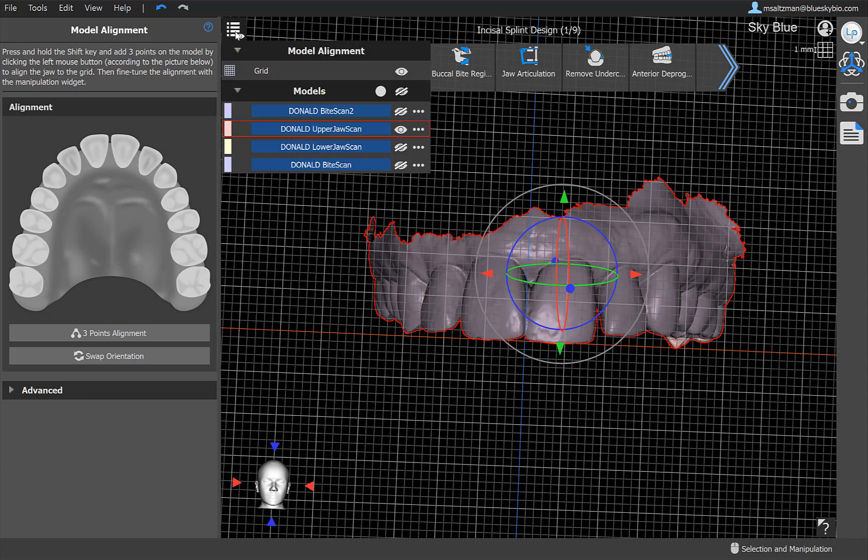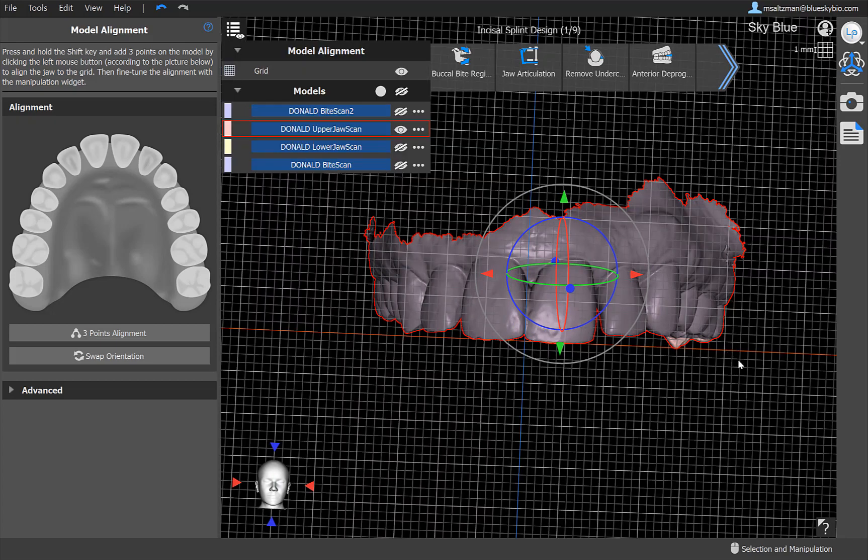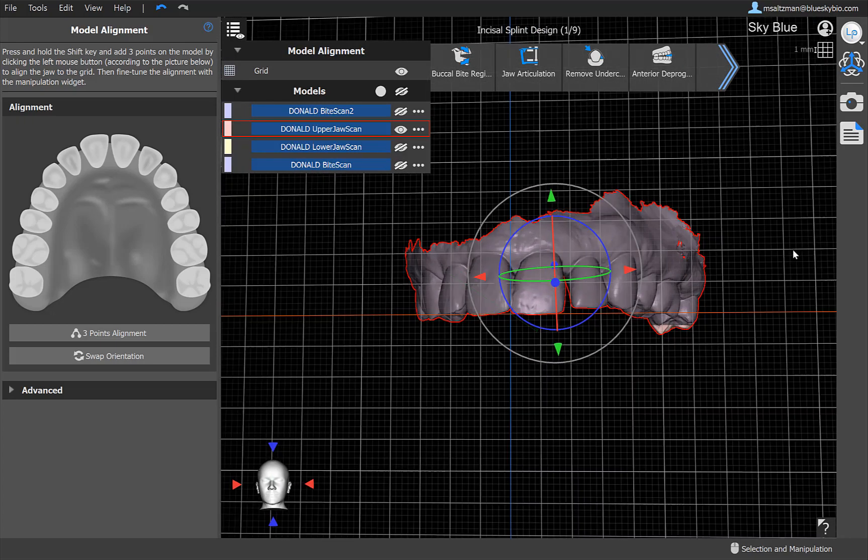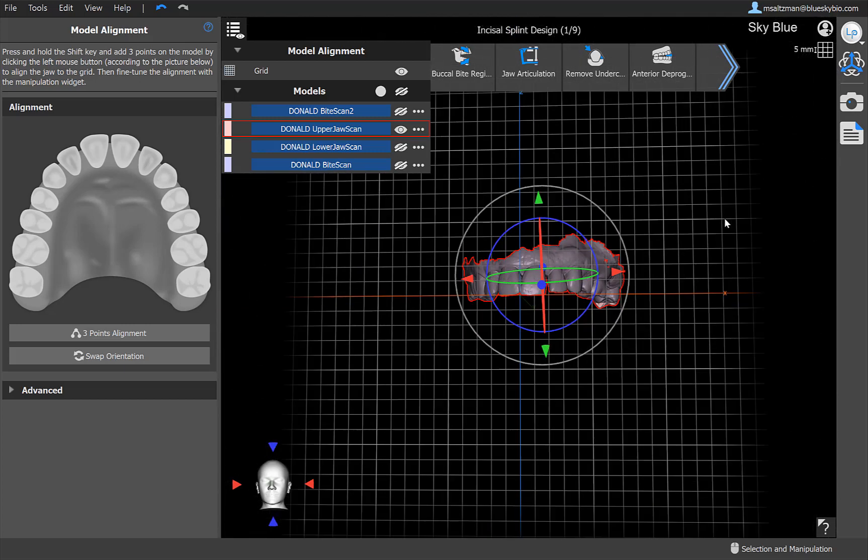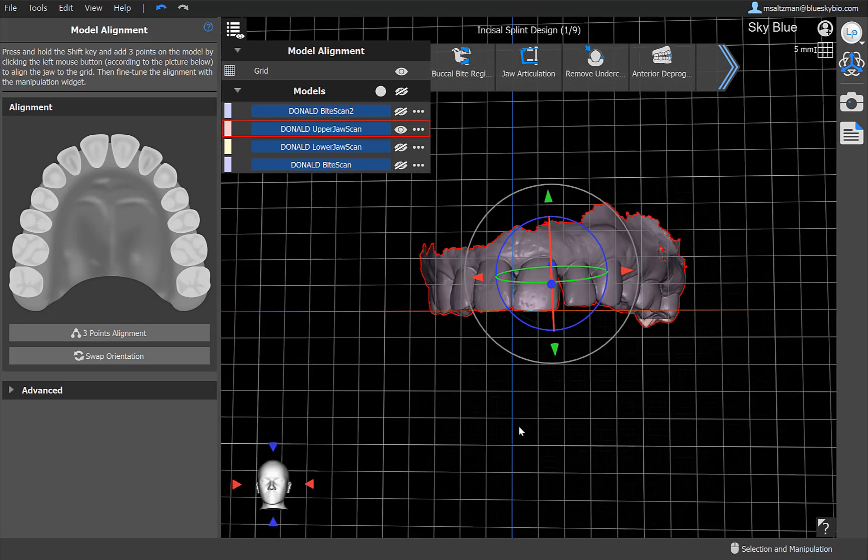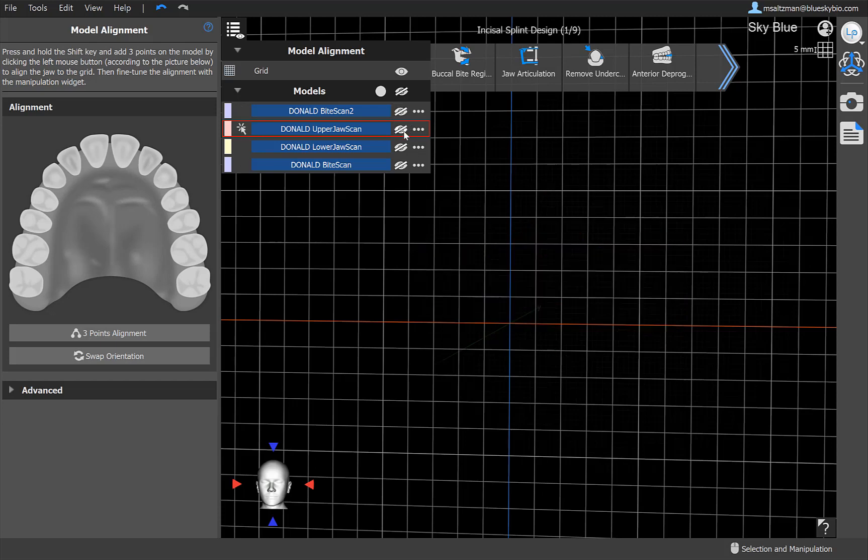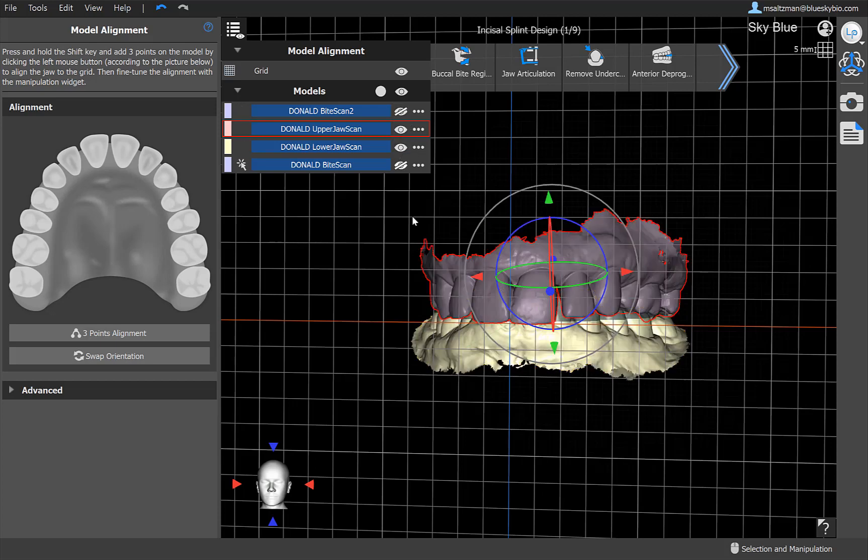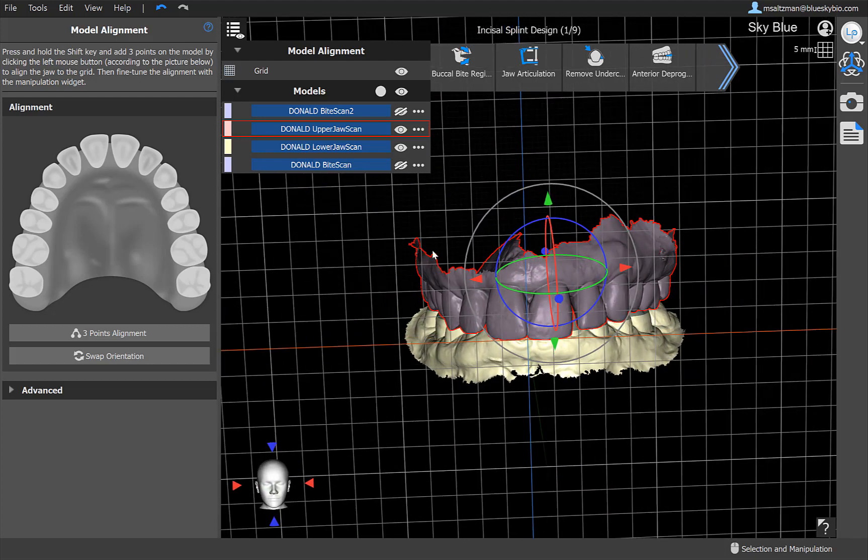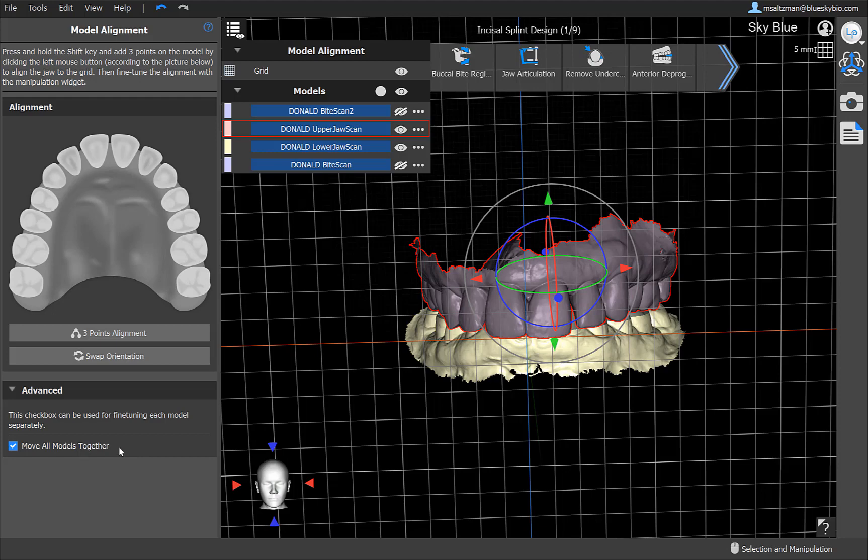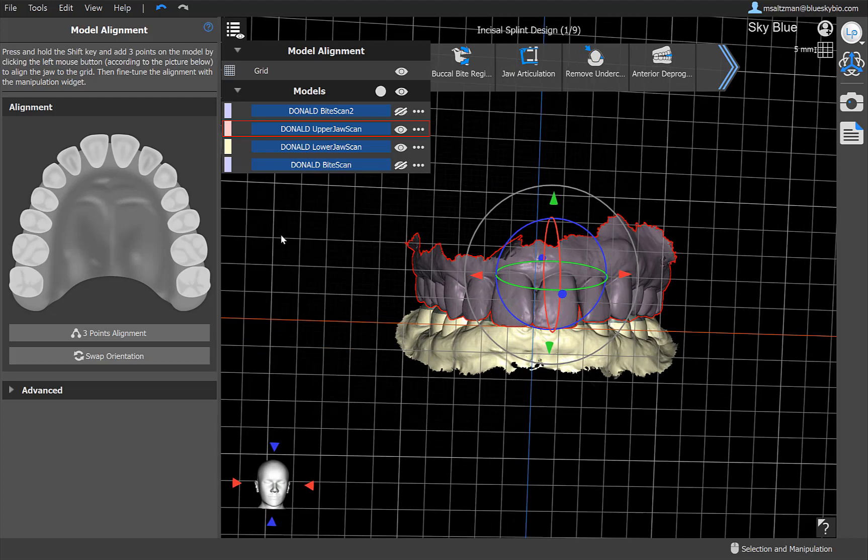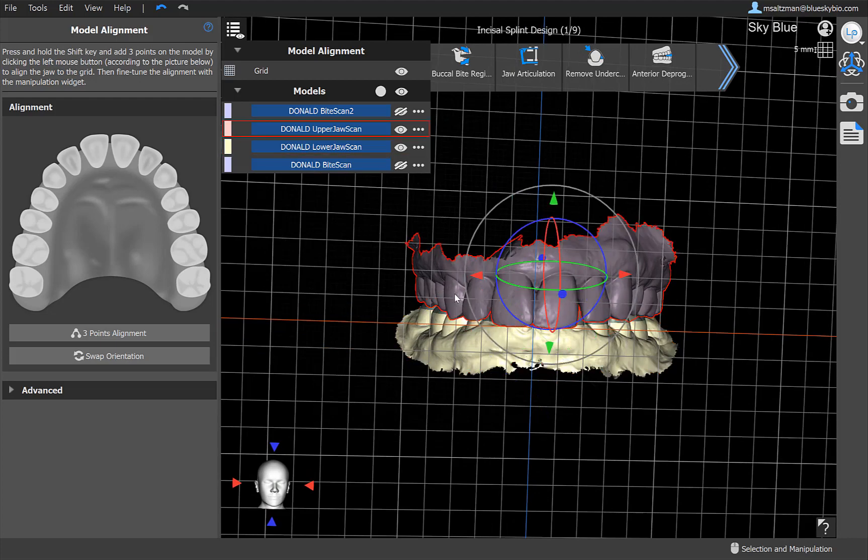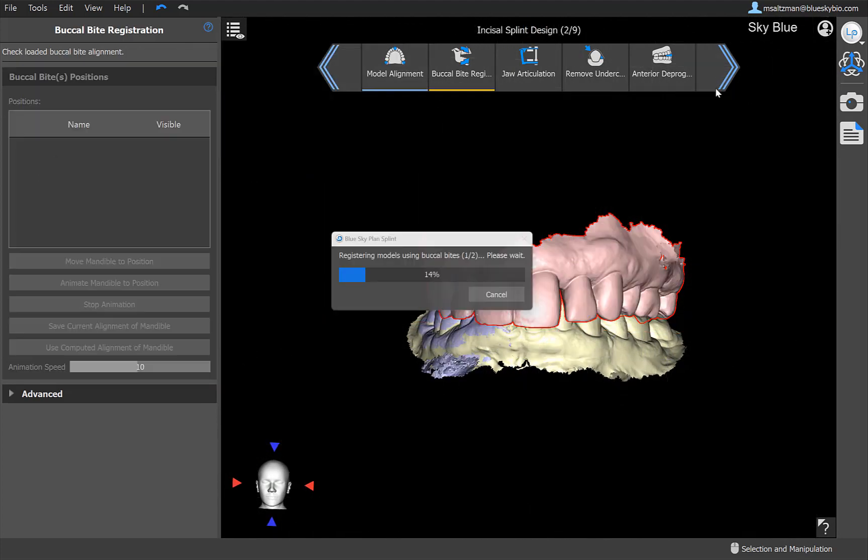If we want to turn off that grid, we could do that through the visibility. And we could also see our key for the grid sizes in the top right. From here as well, by the way, we could toggle on and off our other surfaces. So if we want to align everything together, and we also have that ability through advanced, move all models together, which is checked by default. Once we're happy with our alignment, we go ahead and click on next.